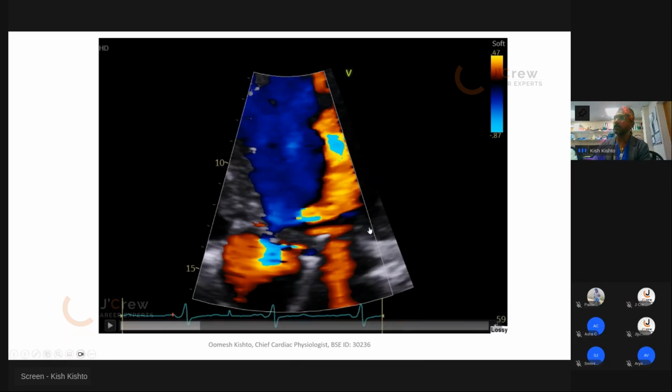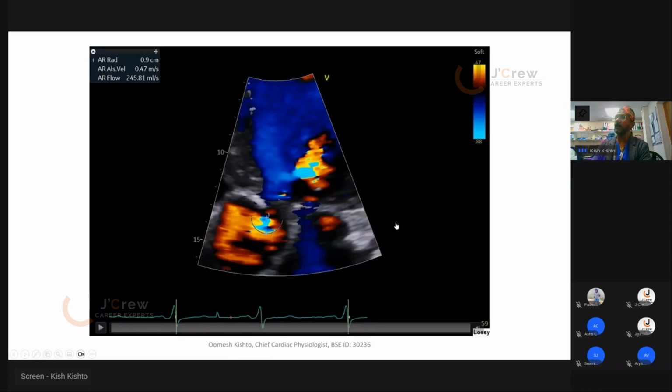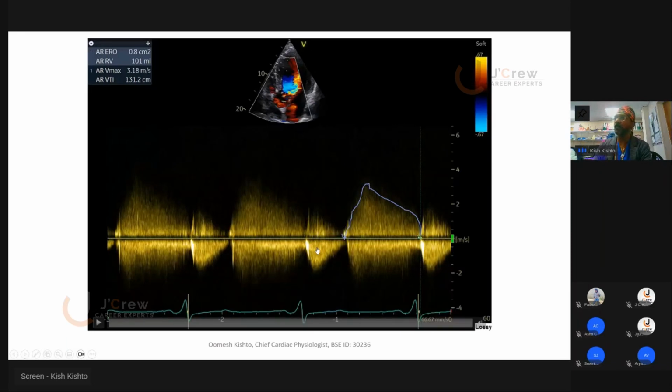All right, and here you go. It's 0.9, I think, just on the borderline cusp of severe. Again, like I said, you see the head and then you see the regurgitation there. So make sure you see the tail of it as well when you measure them. That's the regurgitation, because it was so broad we couldn't get it proper.